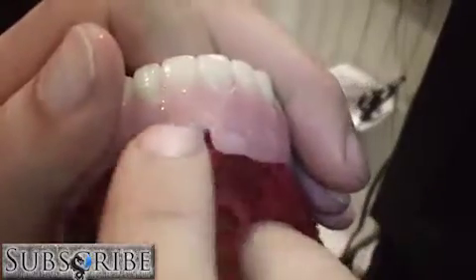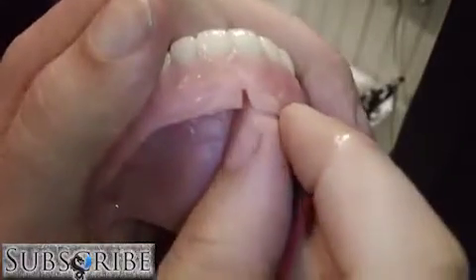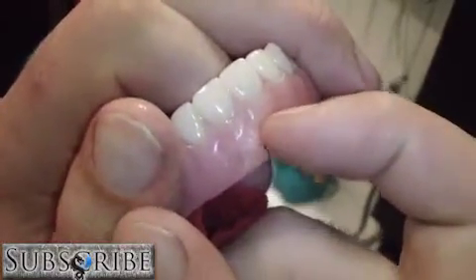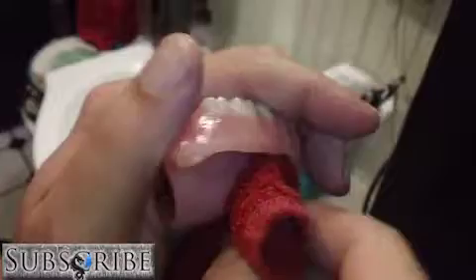Just got to be careful in this ridge because sometimes the dentist has to go in and remake this to contour after the swelling goes down, and it's usually more brittle, though it's still flexible a little bit. I can still flex it just a little, but I don't want to because you can see the ridge line where it's been ground down and then this has been added to it. So just be careful. These are expensive and they're a pain not to have teeth. You can get by, but life sucks without teeth. Generally, usually on the uppers, you just got to dry them off in general. You'll get water around the teeth and stuff.